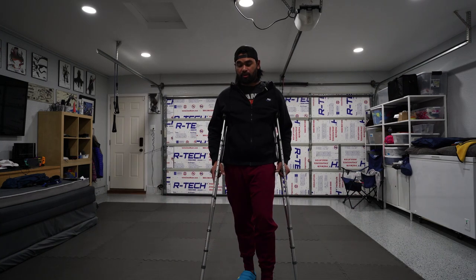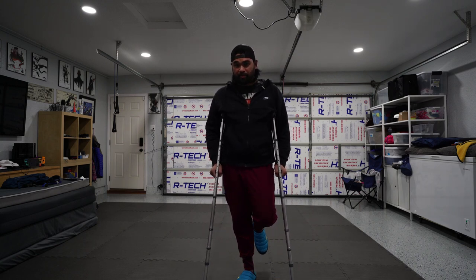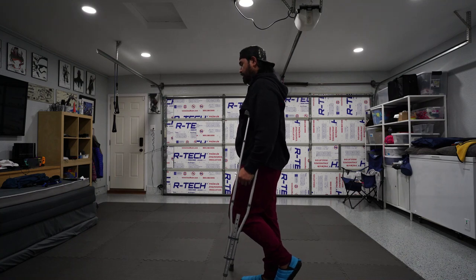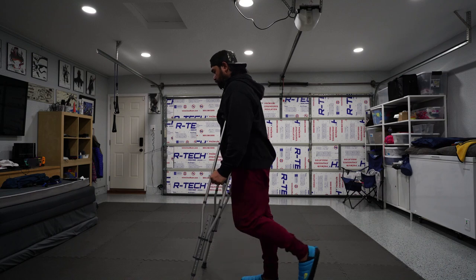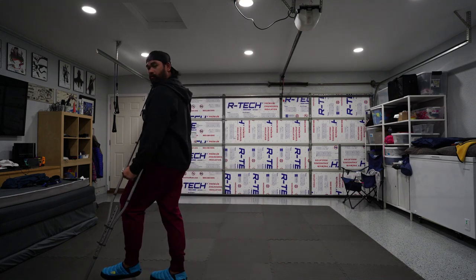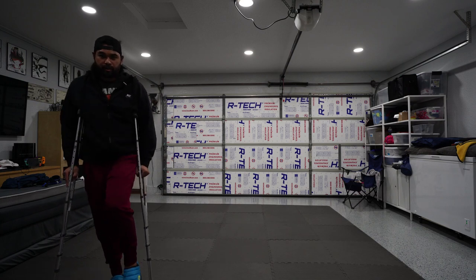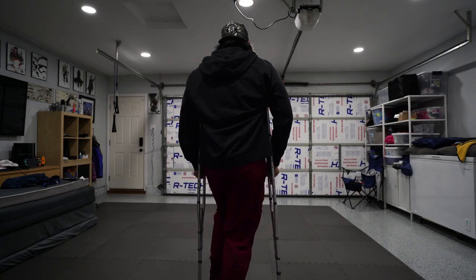The other way you can do it — which is harder — is when you can't put any weight on your leg at all, meaning your leg stays up like this. Your affected side is up, and anytime you take a step forward you're going to bring your limb forward, then hop forward. So it's limb forward, then hop. You're really relying on your upper body for a lot of the weight.